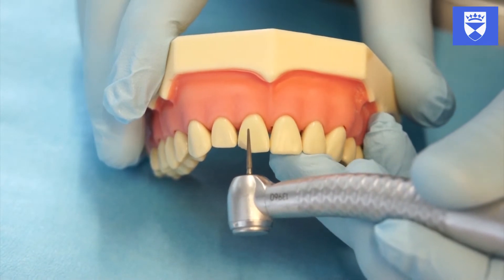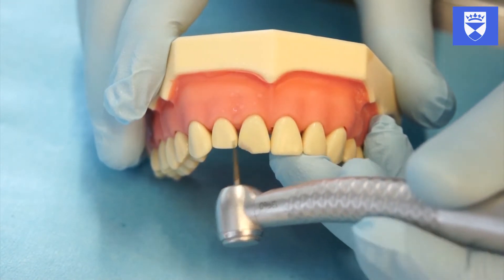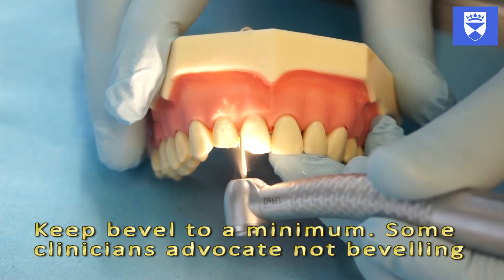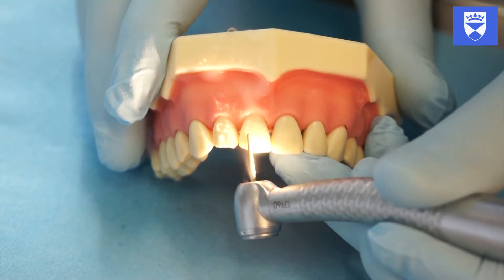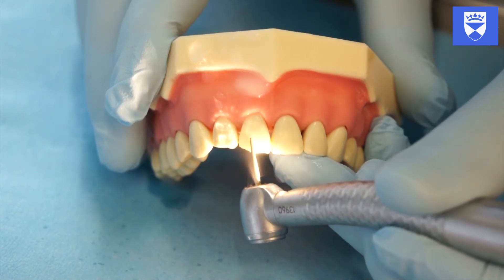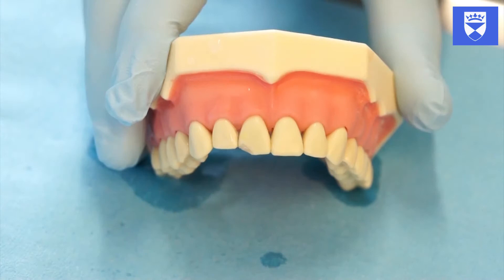Using a high-speed handpiece, bevel the fracture margins with a diamond burr. A composite finishing burr will suffice for this. If a composite bandage is in situ, it is important that this is sufficiently debulked in order to provide room for your definitive restoration.